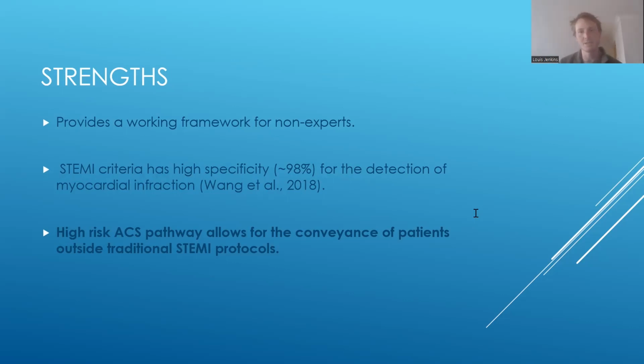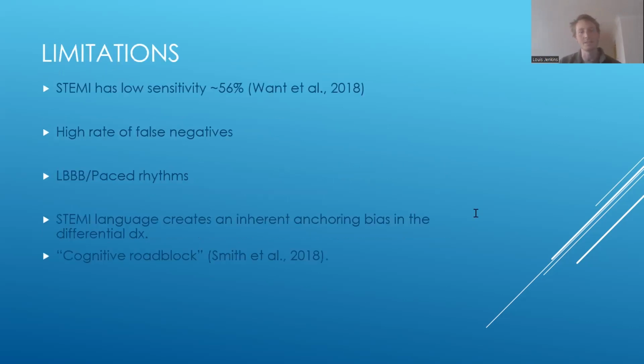So some of the limitations about this tool. I think there are some ways that the tool could potentially be developed a little bit, and the main issue that I see with it is that it's very STEMI orientated. As we know, and I think what we're going to talk about through this presentation, ECG interpretation in itself tends to be a little bit more nuanced than just looking at cutoffs of millimeters of ST elevation in our patients. And I think we all know this intuitively.